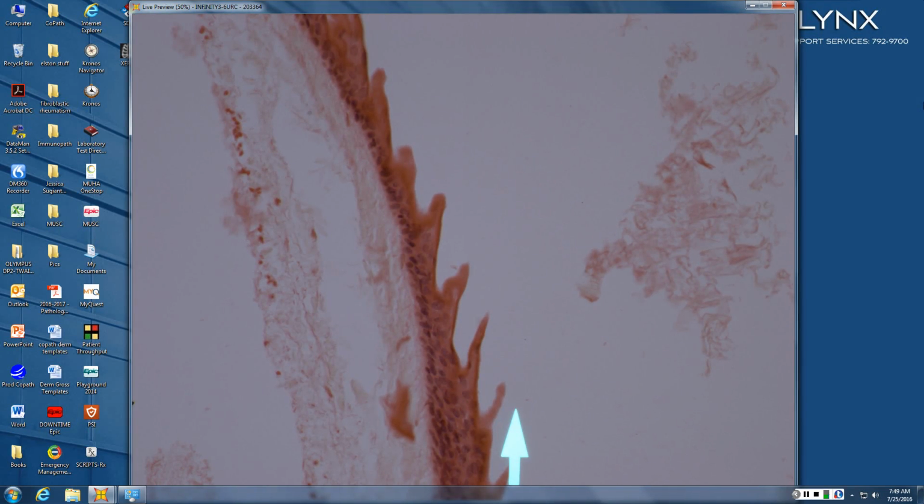So you want to pull back. Which of those 2 has vellus hairs in it? Steatocystoma. Which has terminal hair? Dermoid cyst. Yeah, that's usually the easiest.